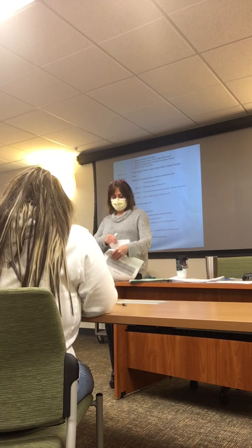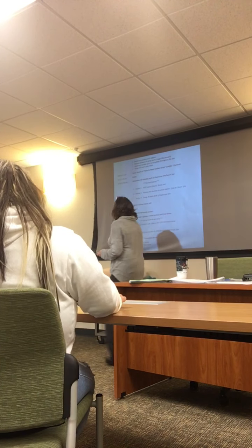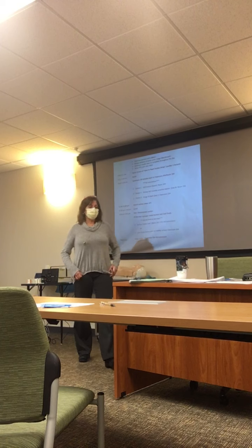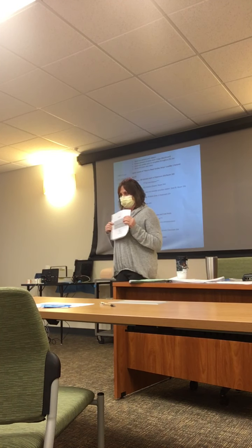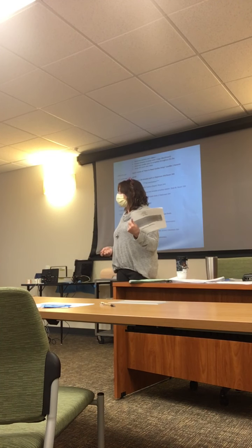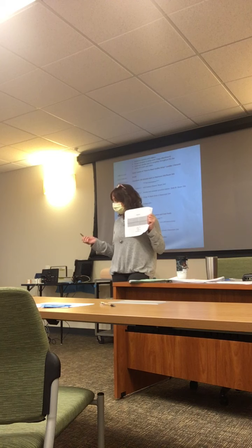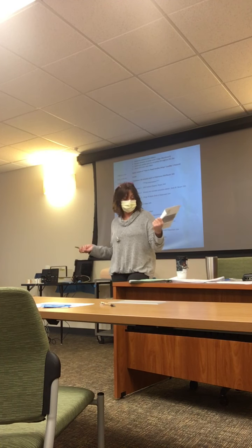All right, this next rhythm is very easy to identify. Not a good rhythm to see on your patient. This is asystole. So, can you see any P's or QRS's? No. So you can't measure any of the intervals or check for regularity. There's no rate to count because the heart is not beating. It's gone. It's stopped beating, basically. Asystole, just like afebrile, no heart rate, no heartbeat.